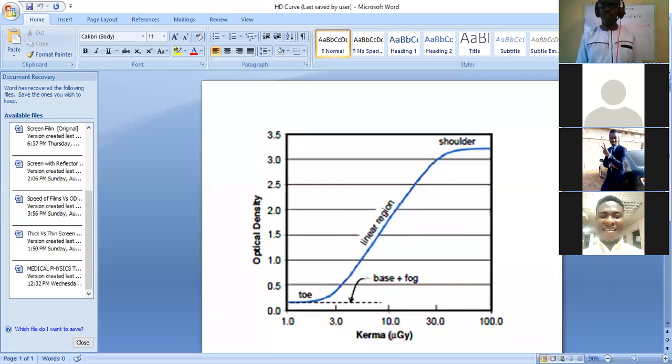Then, when the film has been stored for some time, of course, it could have been inadvertently exposed, maybe with radiation, because most times the dark room is adjacent to the radiation room, I mean the X-ray room, in most facilities. So it is very possible that some little radiation reaches the film. And again, heat: the place the films have been packed will also experience some hotter temperature, and with that, you can have a slightly elevated OD if you measure it with a densitometer.